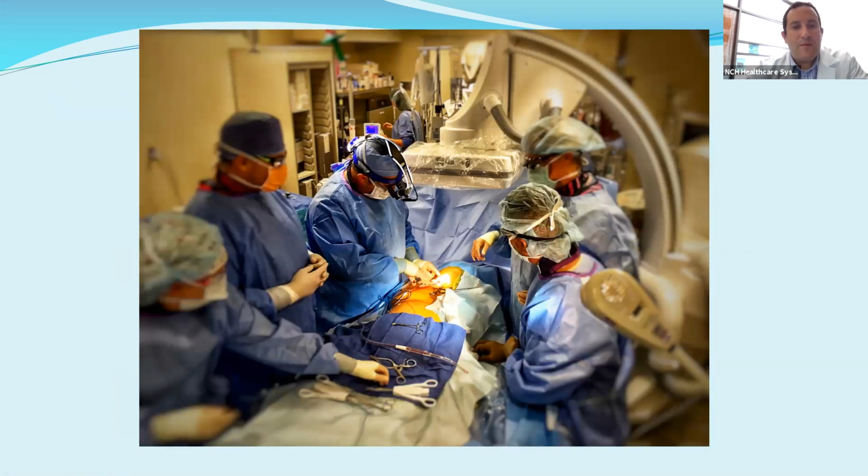This is an image of us doing a transcatheter valve. You see the team working together, surrounding the patient. And in this case, this is an alternate access, us going through the axillary artery in the arm, I believe. Oh no, I take that back. This is a carotid artery approach that we're doing, where we are going through the neck to go directly down to the heart. And we're going to place the valve with only about a 2-inch incision in the neck.